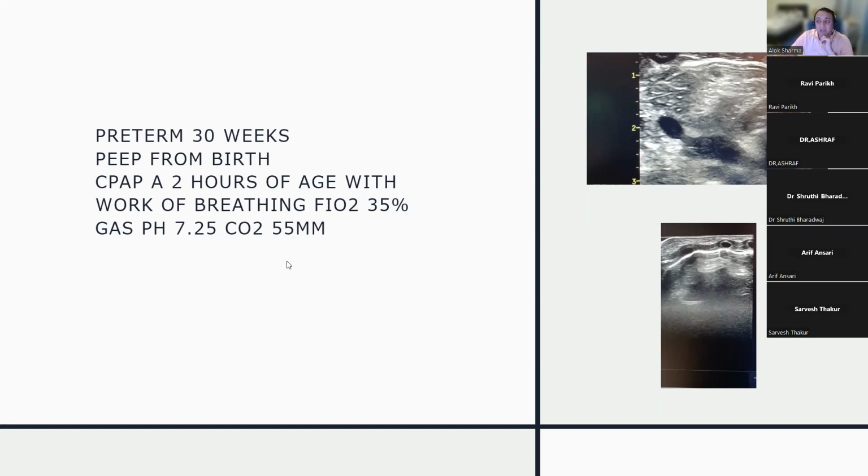Clinically, on examination, this baby has reduced right-sided air entry. And from our perspective, at this particular point, when we transilluminate this baby, it's a little bit tricky because the baby is preterm, he's a little bit edematous, he's quite small, so he generally tends to transilluminate a little bit everywhere. So who wants to do a lung ultrasound? Anybody want to do a lung ultrasound with that history before they give surfactant, or are you happy to give surfactant?